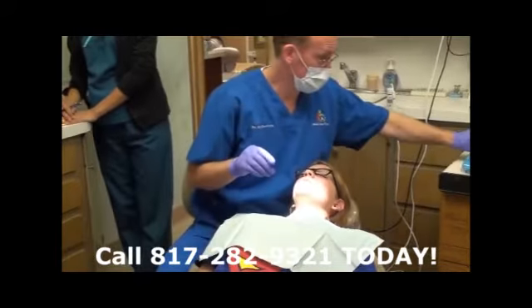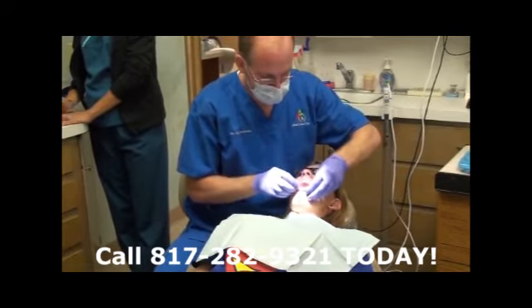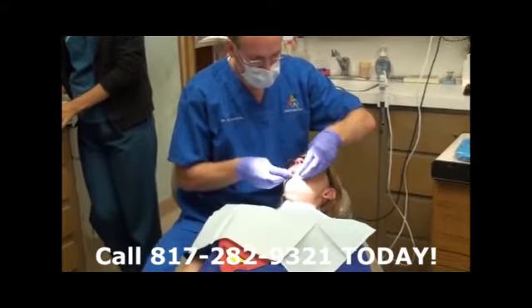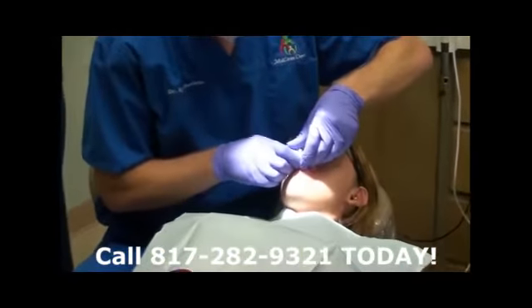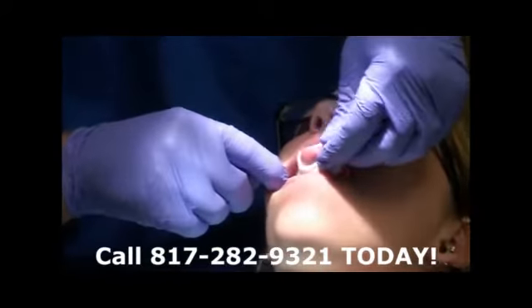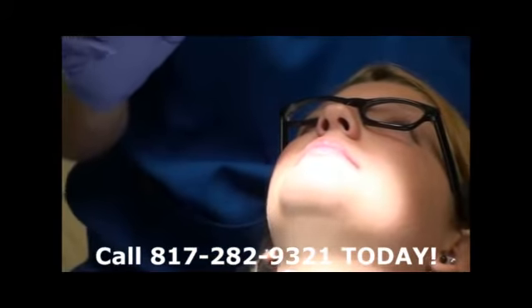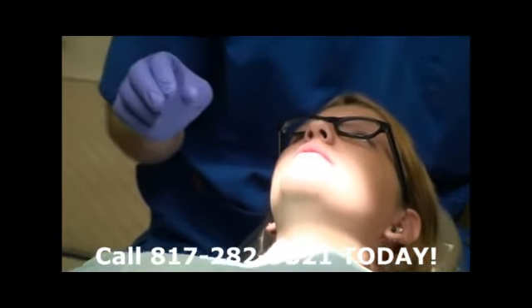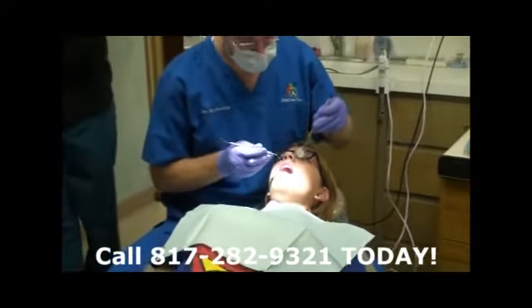What I like to do sometimes is you want to check the sides of your tongue. Let's see, stick your tongue out at me like you mean it. There you go. And I'll just pull that to the side like that. And we just look for discolorations, ulcerations, raised type of lesions, maybe spots that just don't look healthy. And that all looks normal.